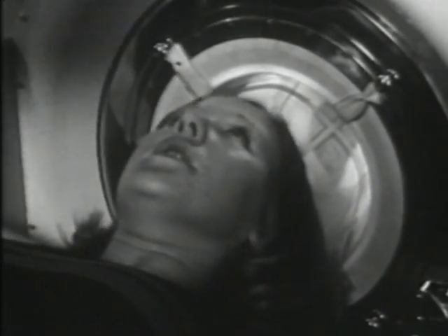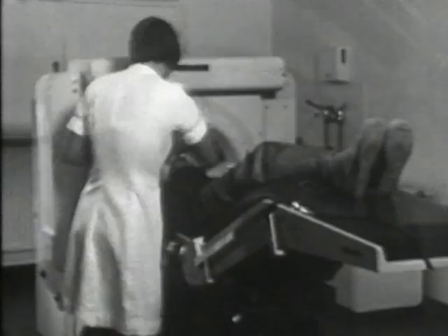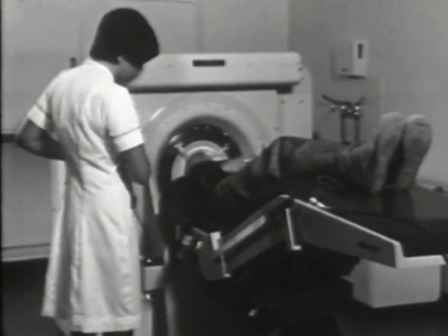accuracy, must be placed in the center of an exactly square perspex box, which is filled with water. This is achieved by forming the front face of the box with a rubber diaphragm, which can be drawn in to form a cap in the center of the box.